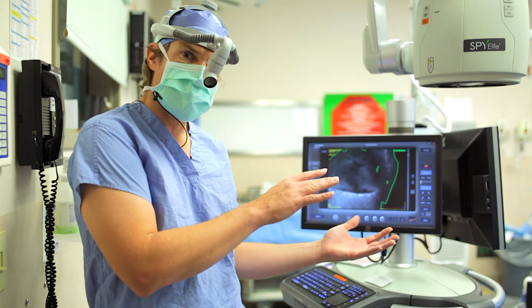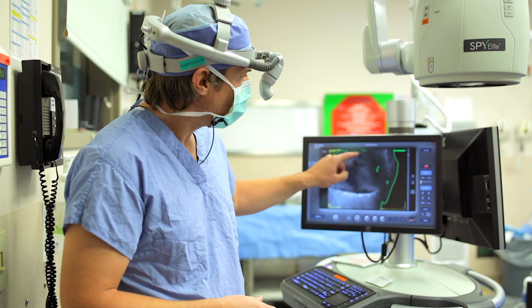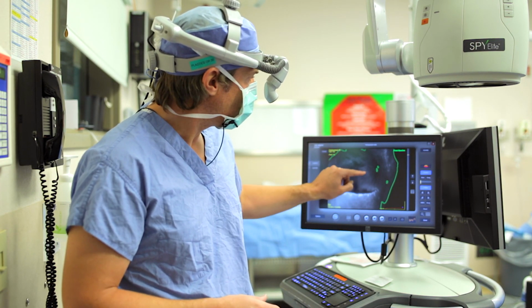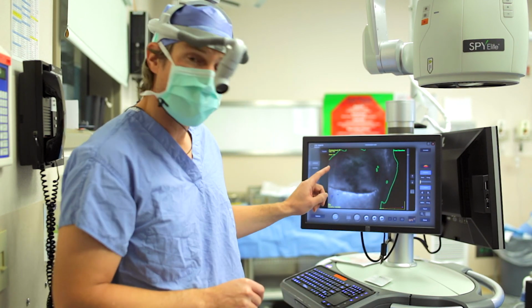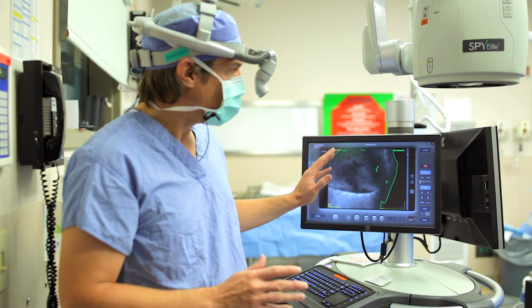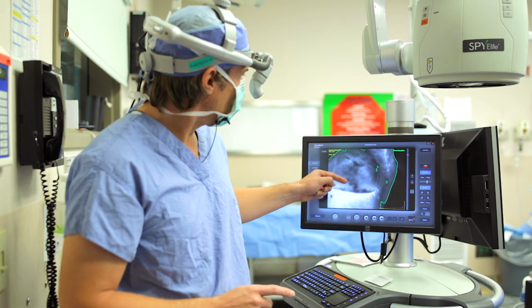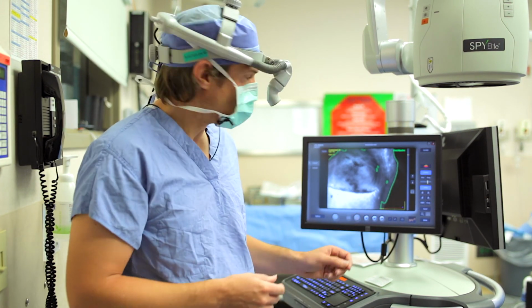We talked about the resection continuum and the reconstruction continuum, its impact on perfusion. I've taken the reconstructive stresses off of it, and again, on that absolute number, that contour 15, it's showing me some false positives out around the corner from the disco ball effect that we talked about earlier. And we look at the area here and say, that looks much better. In fact, if I turn up the brightness for you, you get the sense that this perfusion is improved because we've made an intervention. We've taken the stress off.